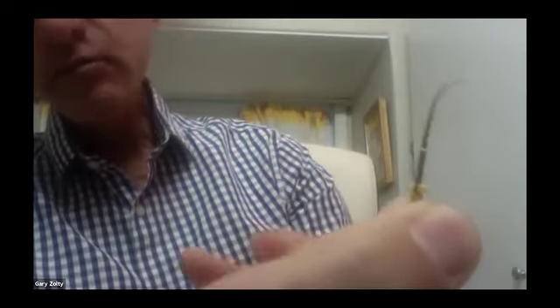But now when we rotate, it's not going to hold that bend in the opposite direction. Now, if the curvature of the root was in that left direction and we rotated, it wouldn't put pressure on the right-hand side of the wall. In fact, what would happen is that because it's soft, it would just flex to that shape. And so it does. As it rotates at 350 revs per minute, it would keep flexing in the direction that you wanted. So that's the, I'll just put a lot more pressure on it. Hope it's clear. That's the gold.